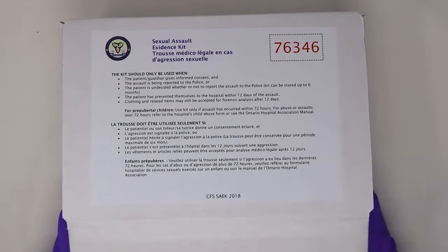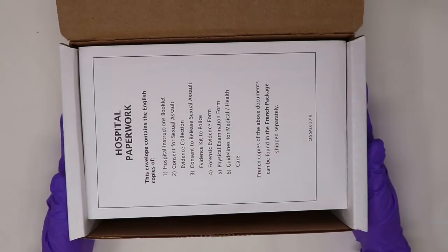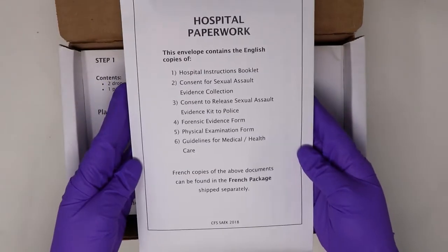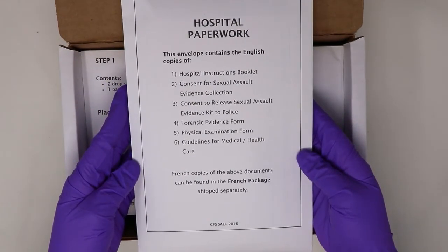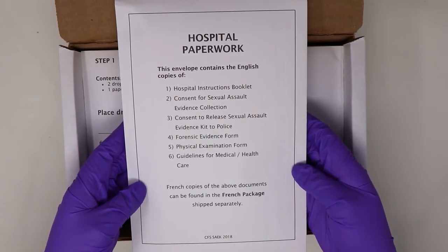The hospital paperwork bundle is contained within an envelope at the top of the kit. This envelope contains a hospital instruction booklet, 2 consent forms, one for the collection of the kit and a second for the release of the kit to police, the forensic evidence forms, physical examination forms, and guidelines for medical and health care.